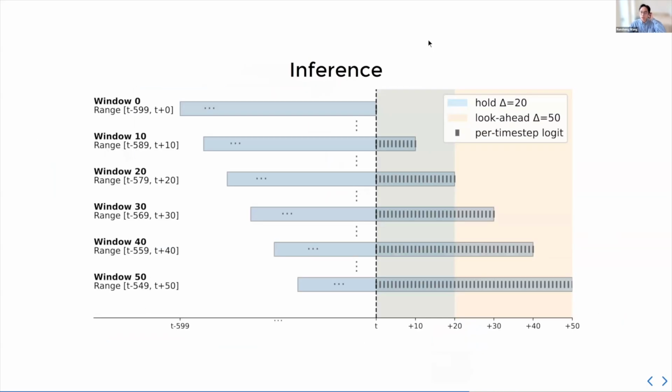So it runs in real time because the look-ahead period is small enough. We actually need to use future data to make predictions about t. In practice this manifests as an unavoidable delay, because we want to look at future time steps, since a single time step does not tell you a lot about EMG. You can think of this as post-processing, but it's done online in real time at the cost of a delay. How much delay is acceptable is up to you.